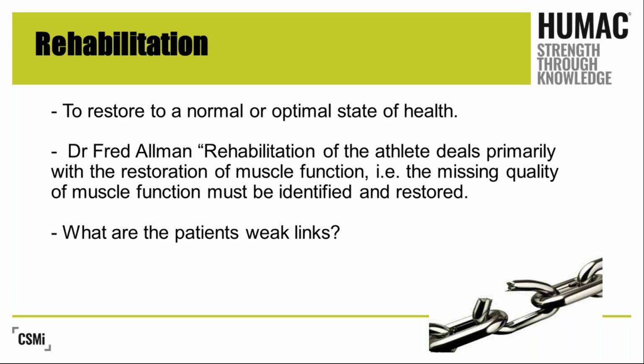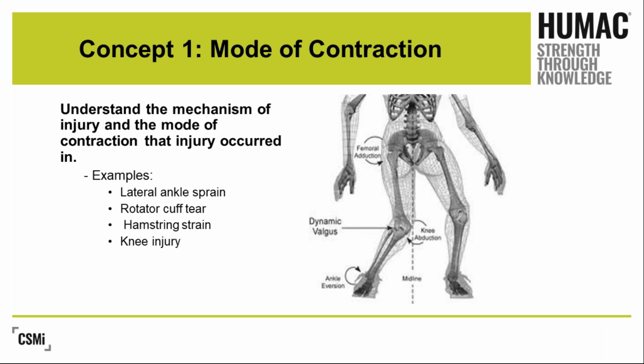So he would come back in, and we would test him again, concentric. And then he would go back out, and we'd say, everything looks fine. Let's go back out. Let's do this again. And so he came back, and he told us that every time he lunged for the ball, his quadricep, his knee felt like it wanted to give way. So finally, we identified that every time he did an eccentric motor contraction, he had an issue. So we found a machine that allowed us to actually look at eccentrics in the early 80s. And we found that he had a significant eccentric deficit, but not a concentric deficit. And we're going to explore a lot of those different issues that we see.